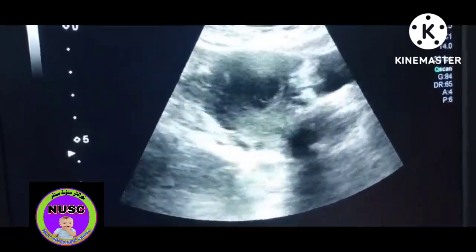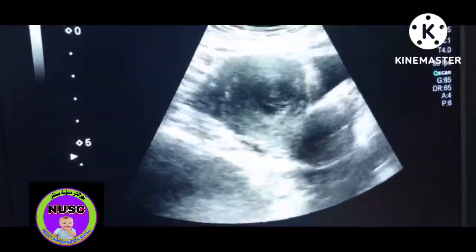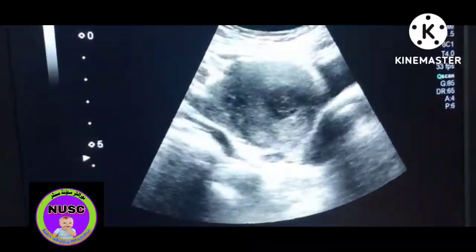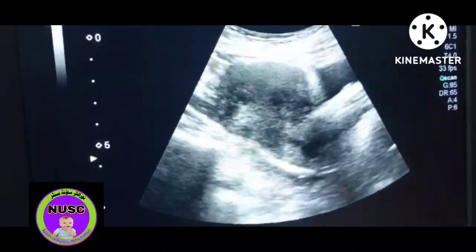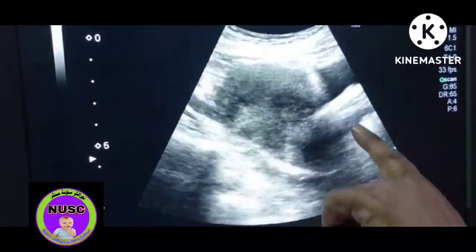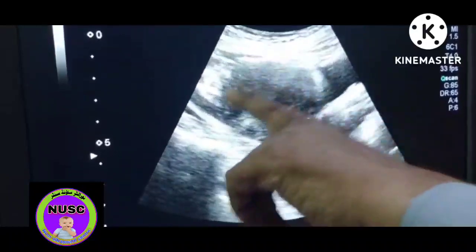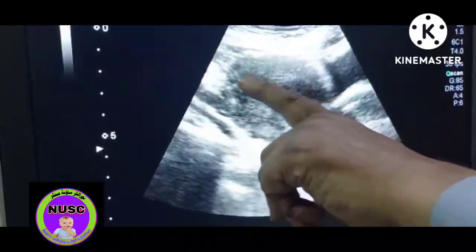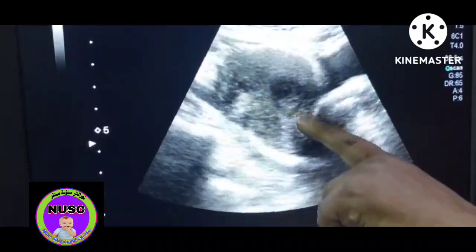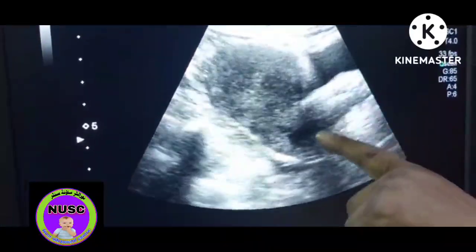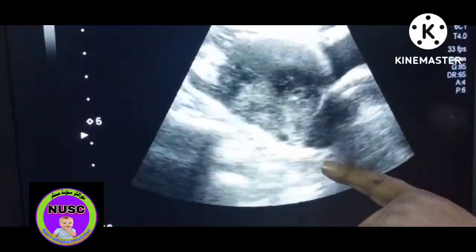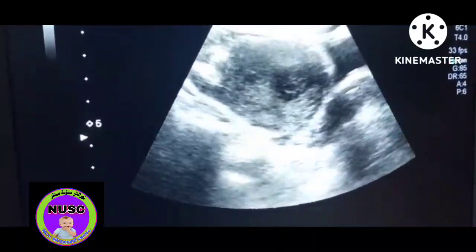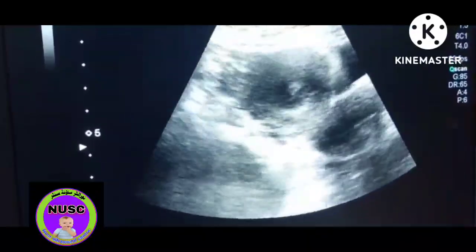Here we are performing a pelvic scan; the patient is complaining of PV bleeding. This is the uterus. This is the fundus, body, and this is the cervix, as you know already.